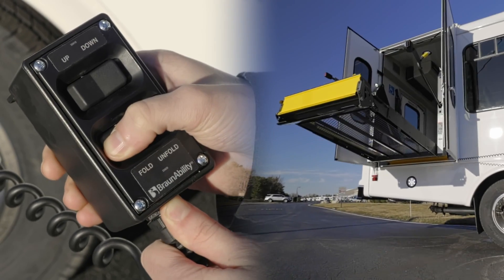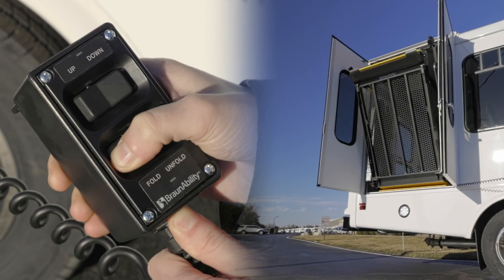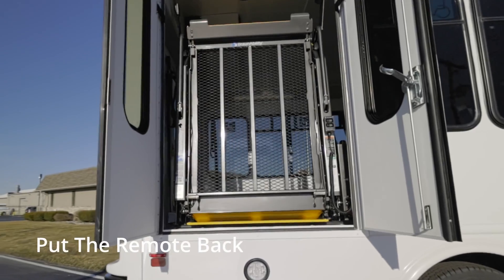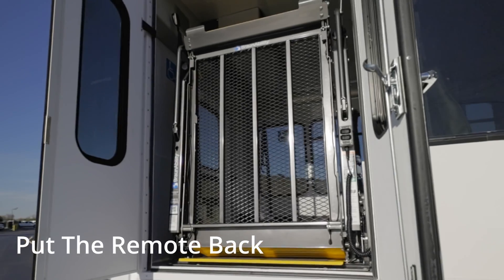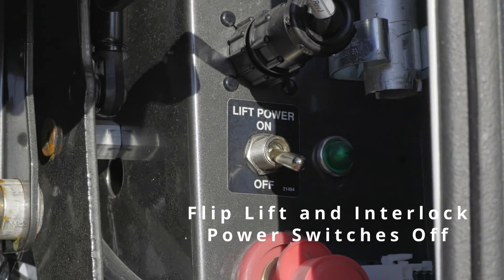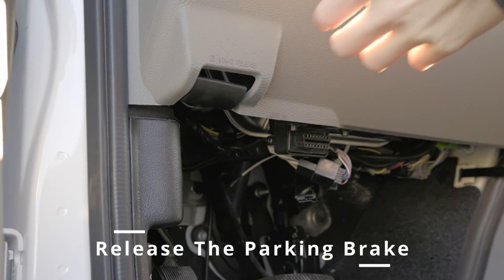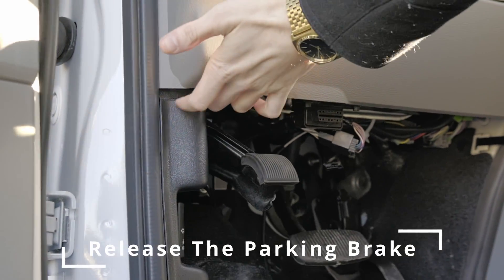Then, when the platform is clear, hold the fold button to bring the lift back to its upright position. Once it's folded back up, put the remote back, flip the power switch to off as well as any other wheelchair power switch, close your doors, and release your parking brake before getting back on the road.